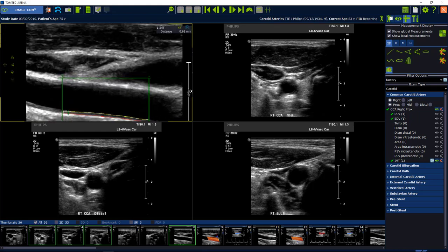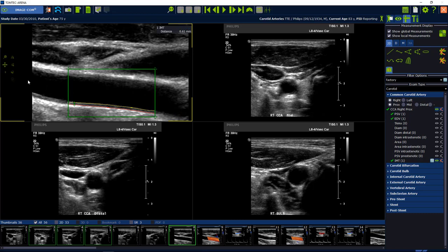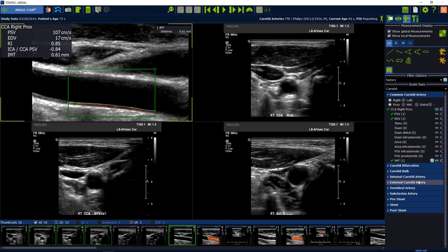You can zoom in and move the image around to review the results. The measurement will now be shown in the left upper corner. The results are automatically stored in the Imagecom worksheet which can be opened here.